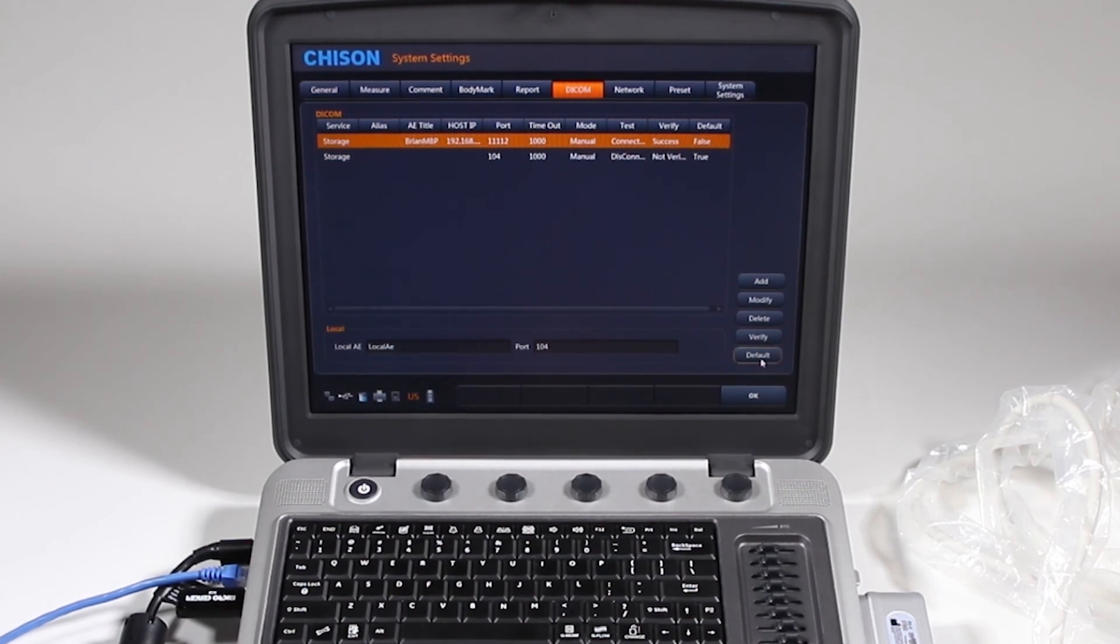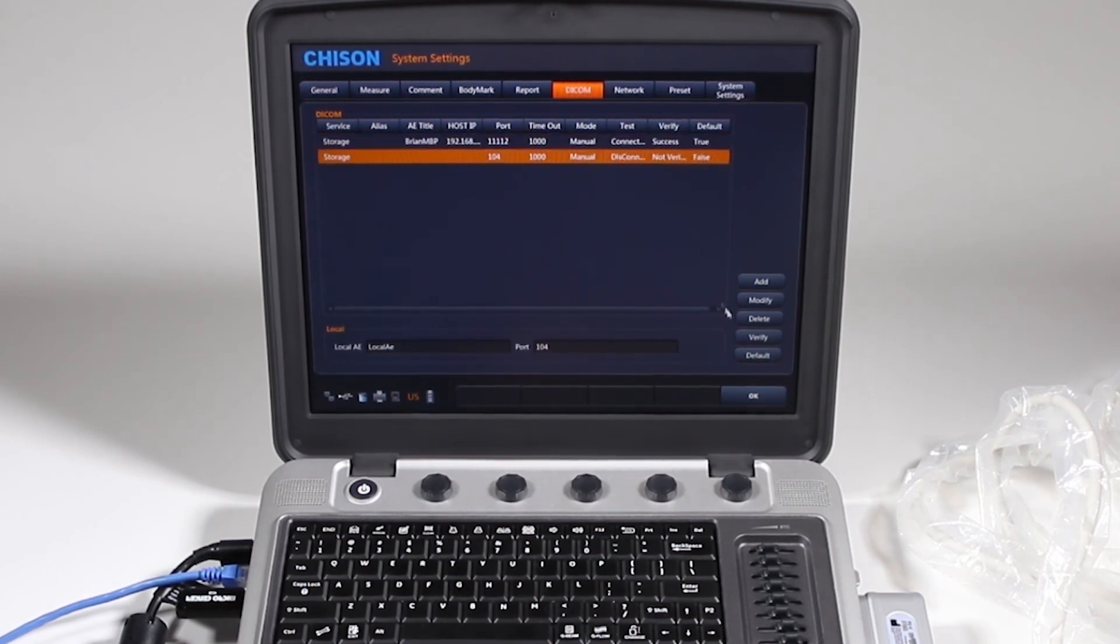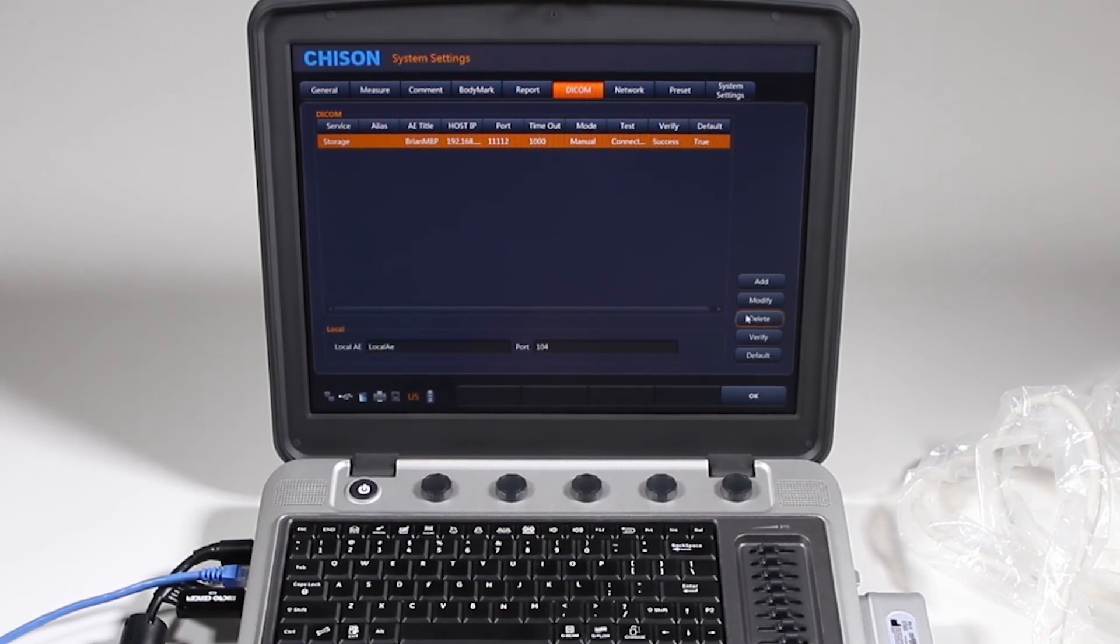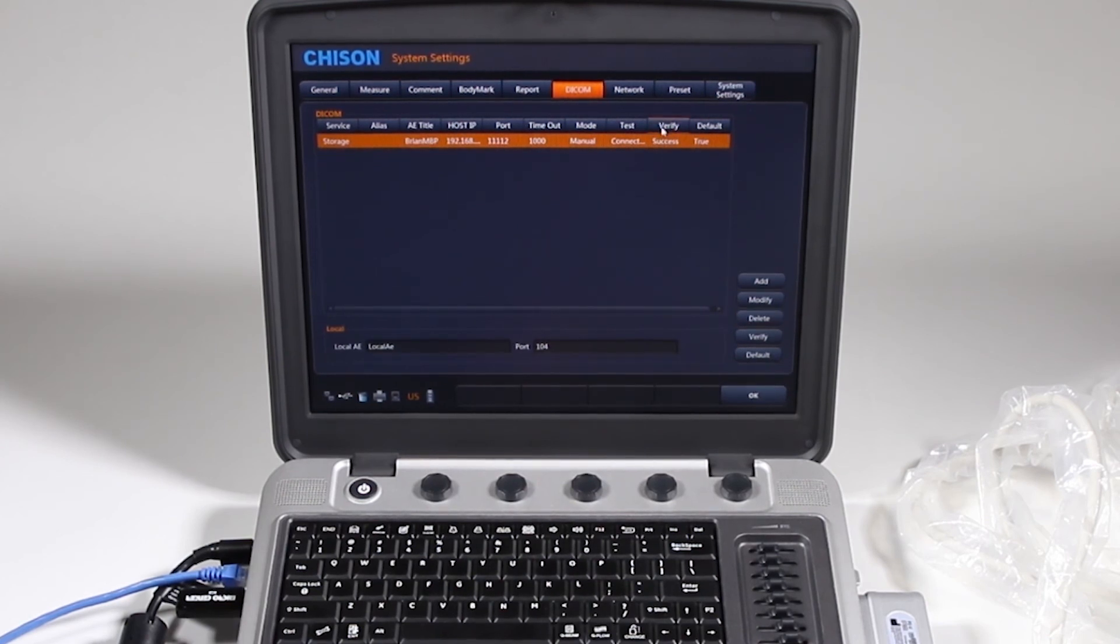I want that to be my default. Now I don't want this one here because it doesn't work. I'm going to go ahead and click delete and that's setting up your DICOM and your network.